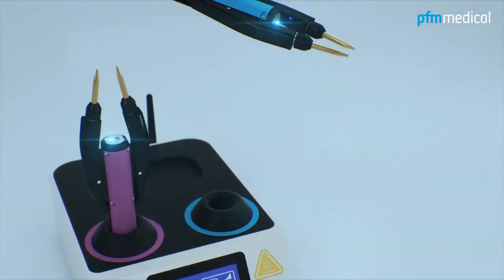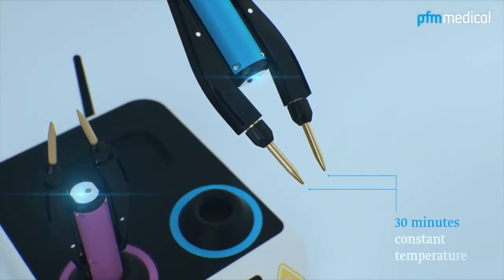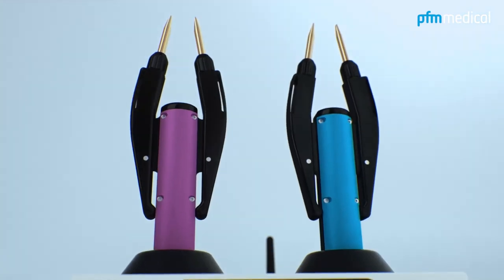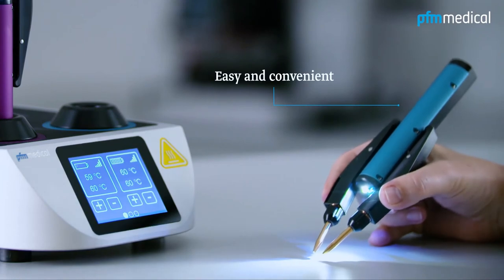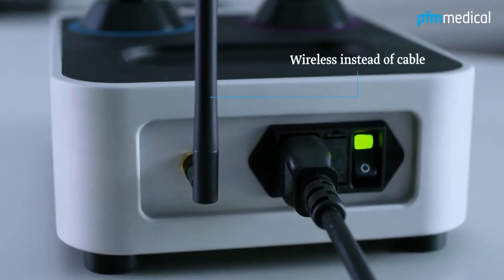During application, the temperature of the forceps tips remains consistent for 30 minutes. It provides a safe transfer and alignment of histological tissue samples as easy and convenient as never before. Wireless instead of cable.